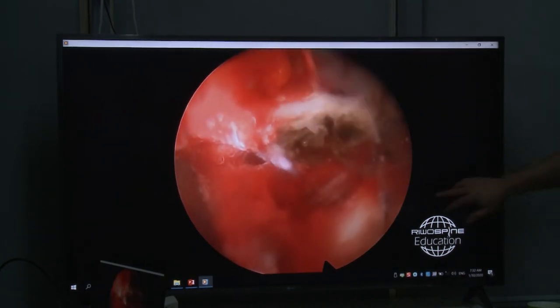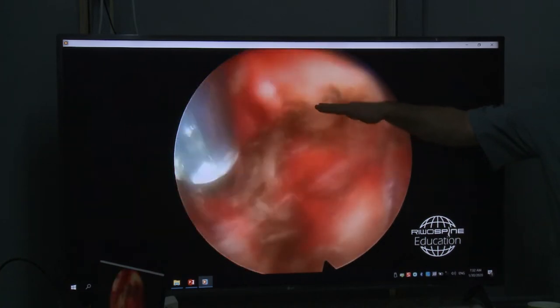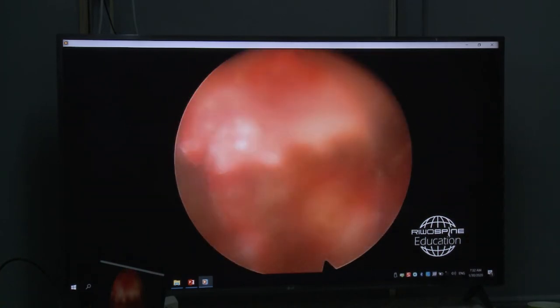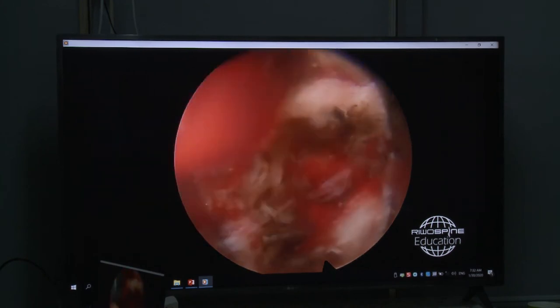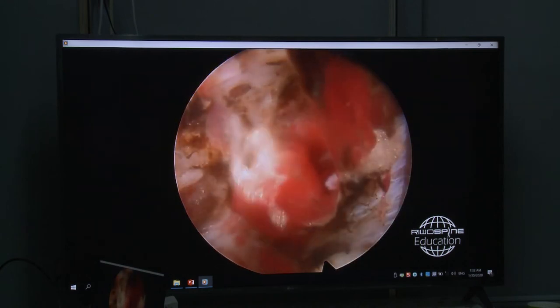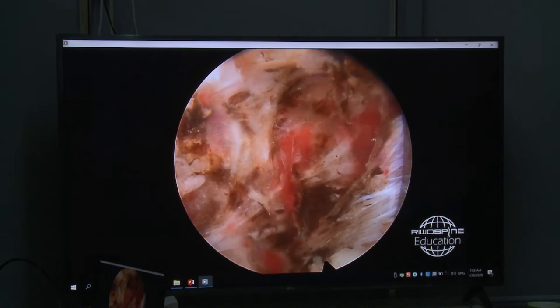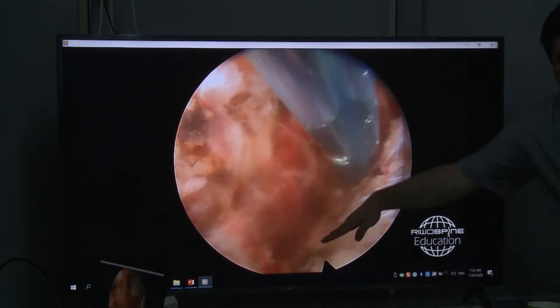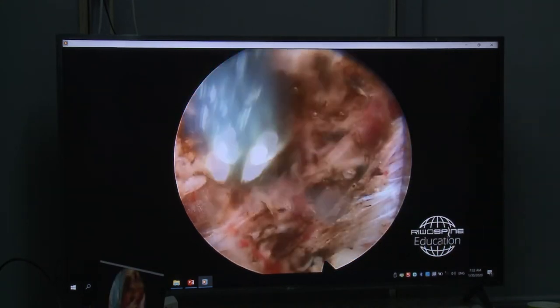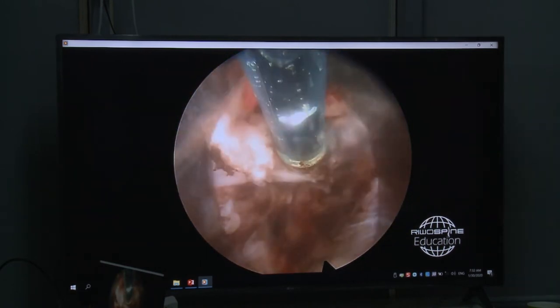PLL? No, PLL is here in this case. This is the capsular facet joint, probably, because the herniation is above the PLL. You see the horizontal fibers now. These are the vessels, the epidural space, and the PLL here.